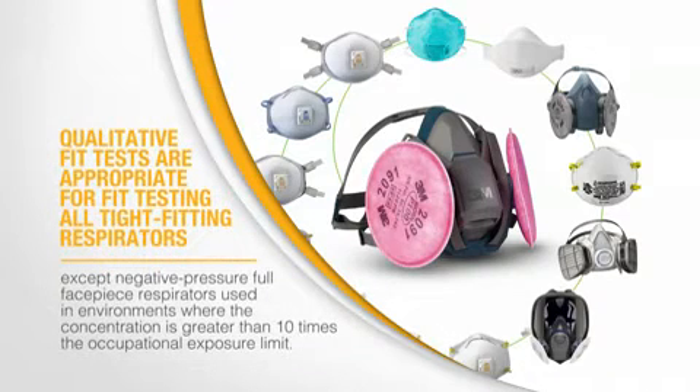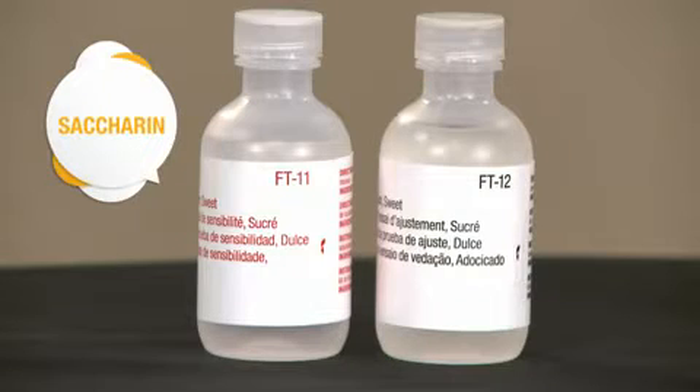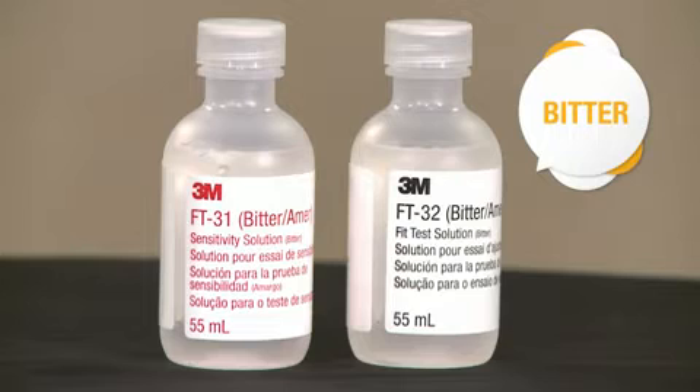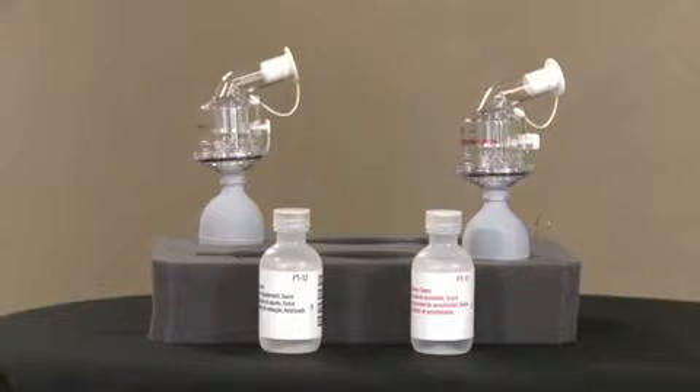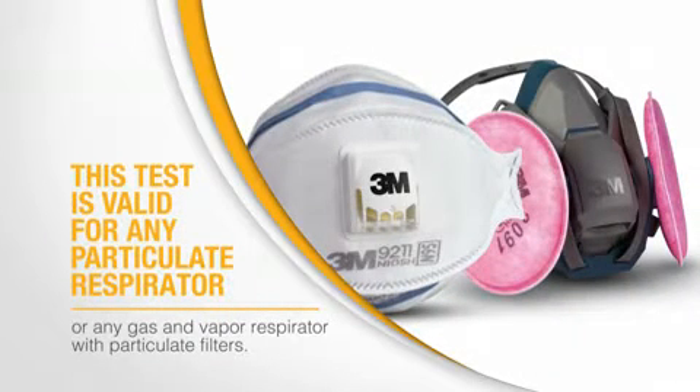Qualitative fit tests are appropriate for fit testing all tight-fitting respirators except negative pressure full facepiece respirators used in environments where the concentration is greater than ten times the occupational exposure limit. One type of qualitative fit test can be performed with a mist that contains either saccharin, which is a sweetener, or a bitter-tasting substance known as Bittrex. The test process is the same for both test agents, and your instructor will tell you which material will be used for your fit test.